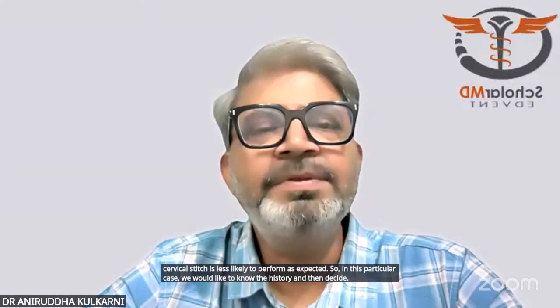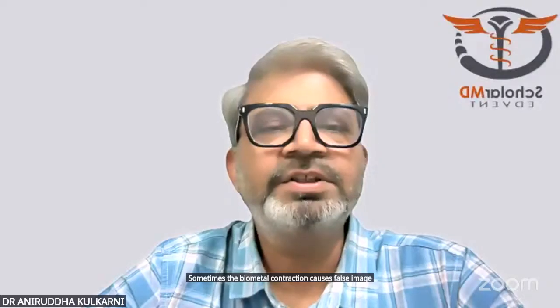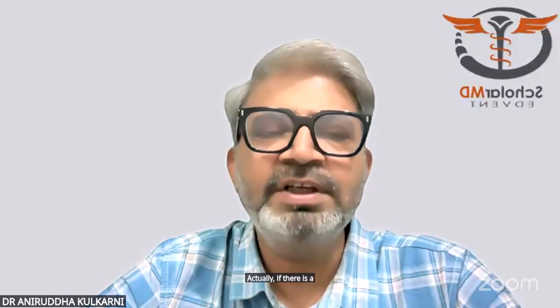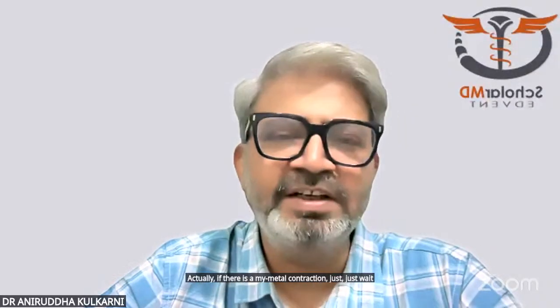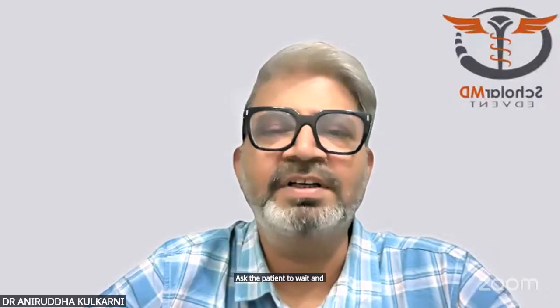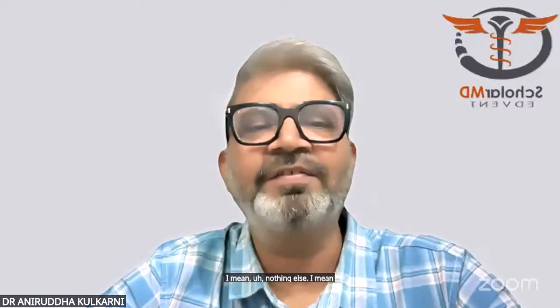Okay. Sometimes myometrial contraction causes a false image, Dr. Shamal. If there is a myometrial contraction, just wait patiently. Ask the patient to wait and re-examine the patient. Nothing else. You have to do the rescan once again.